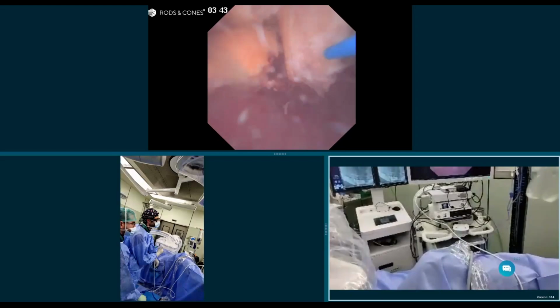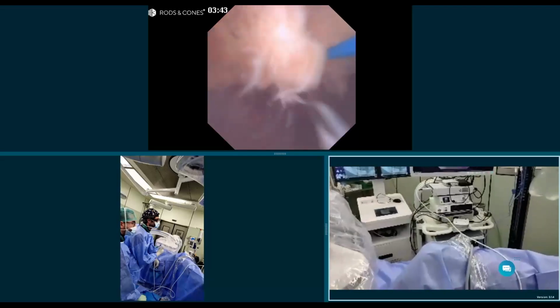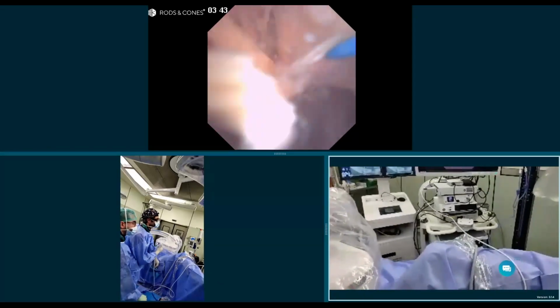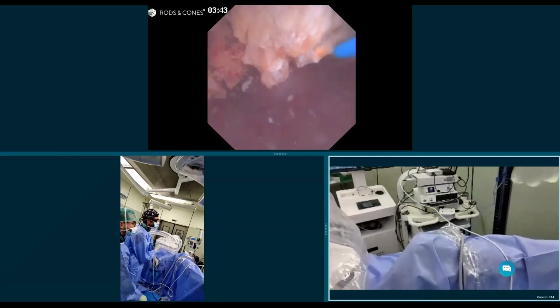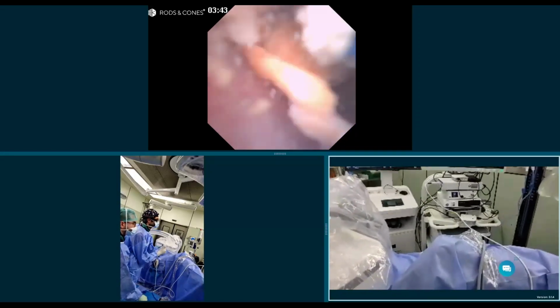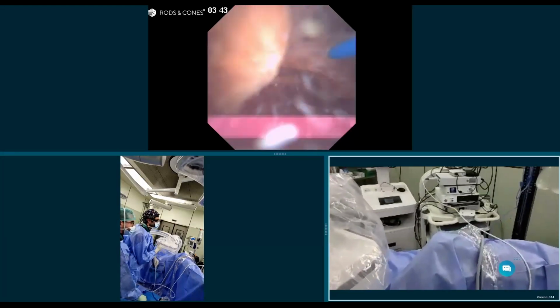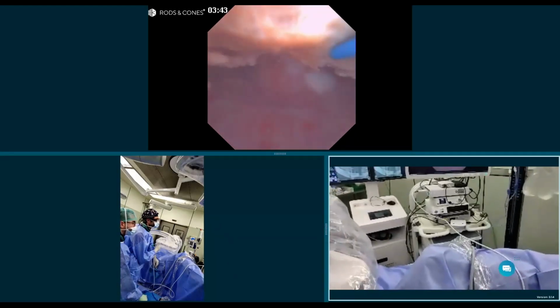I like to dust, especially when you have suction devices. These aspiration devices will give us the opportunity to increase stone-free rate and reduce increased pressures on the kidney. We really need to start doing some research and knowing how this influences patients, but we already, let's say, have a sense and know that it's going to work. You know that the most important causing factor of complications in flexible ureteroscopy is precisely increased pressure. So what you need here is a good laser where you can dust.